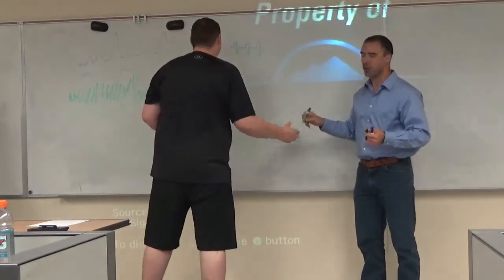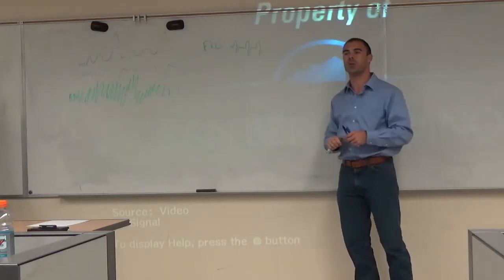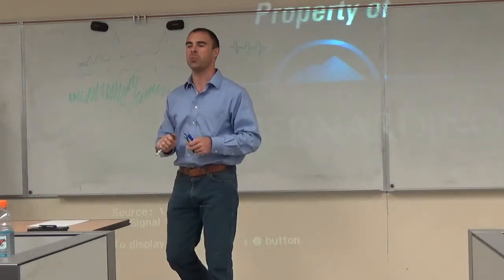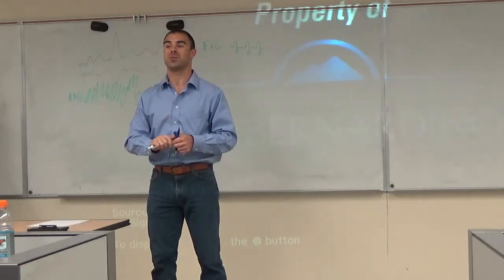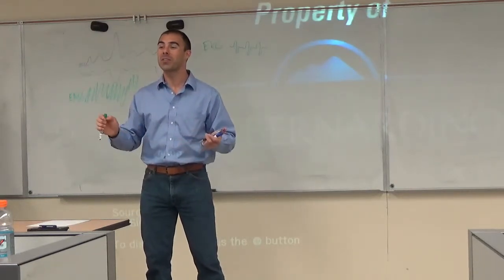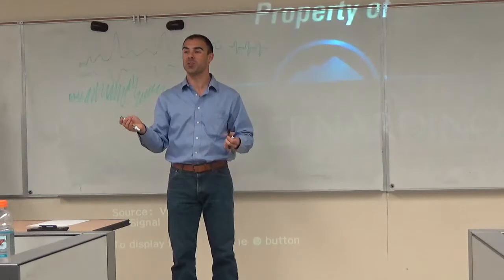Good job. Okay, so George, when we were talking about the VEOG and the VEOG lower, you mentioned another artifact a few minutes ago that would be tapped into particularly by the HEOGs. Do you remember what you said? Saccades, yeah, okay, so saccades are another artifact that we talked about, right? Do you want to draw us what they might look like?